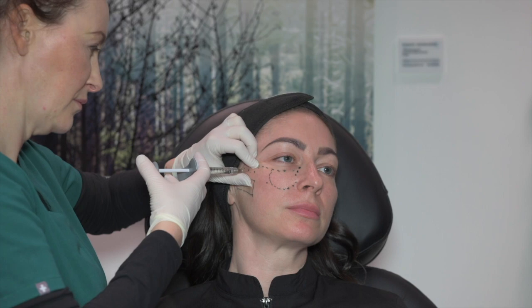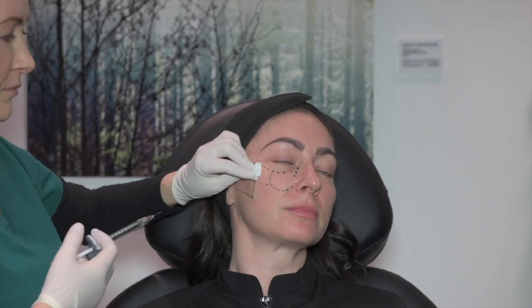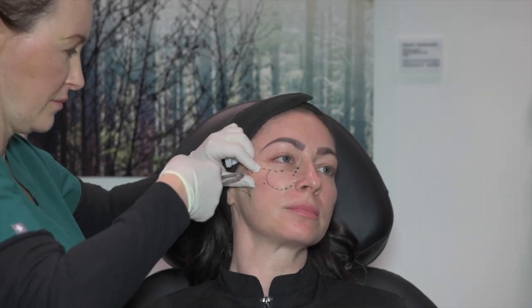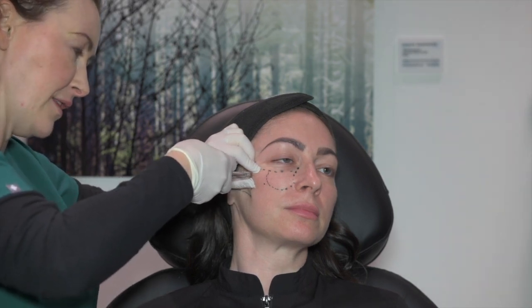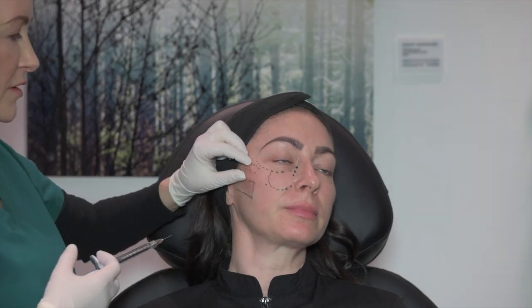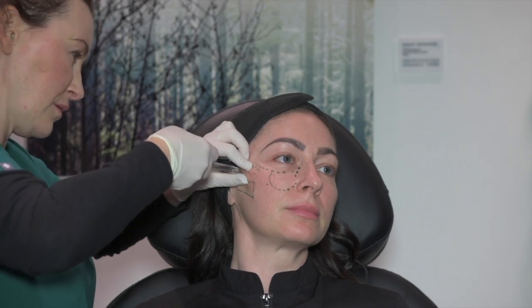So now we're going to move to treating CK1 with Voluma. So we clean. Always make sure we clean before each point. And then we retract the skin, needle to bone, aspirate, and 0.1. Second point, retract, inject, aspirate, and then 0.1. And the posterior point, inject, aspirate, 0.1.